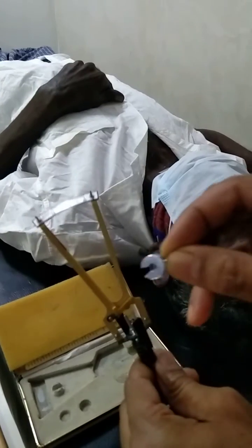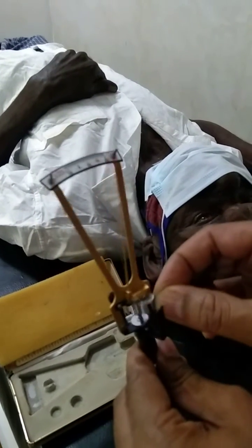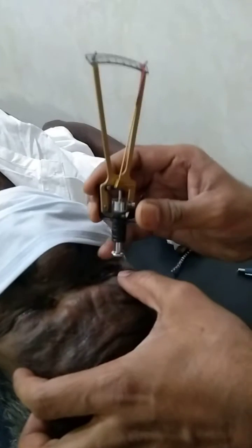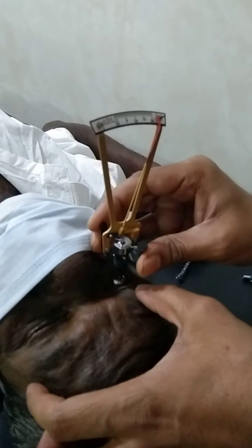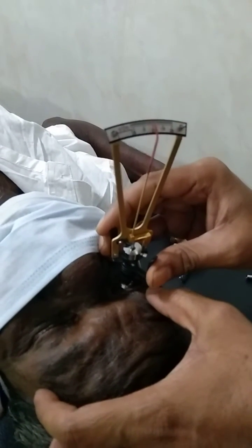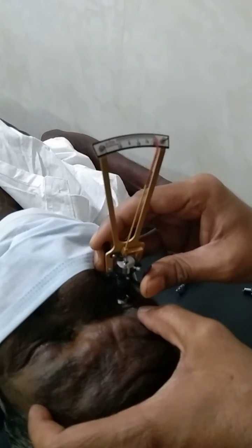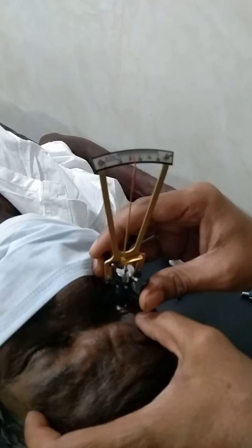Since the reading is showing 0, we need to increase the weight on this Schiotz tonometer — we will put the extra weight here and recheck. So now after inserting the 10 gram weight, we will check again to see the reading. You can see that it is now showing at 6.